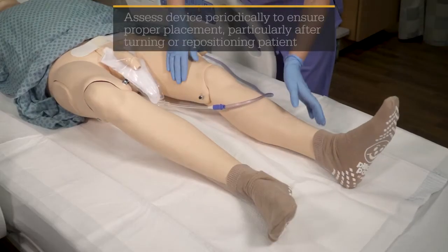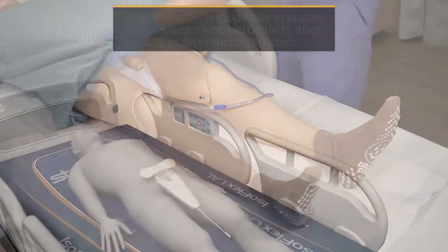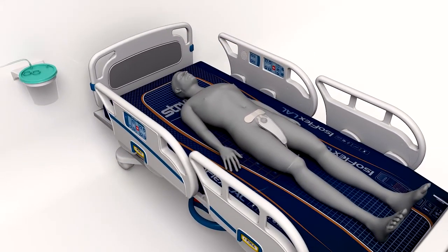Return the patient's legs to a closed position. When properly positioned, PremoFit's soft wicking fabric absorbs and diverts urine away from the patient's skin. Urine is then suctioned into a collection canister.